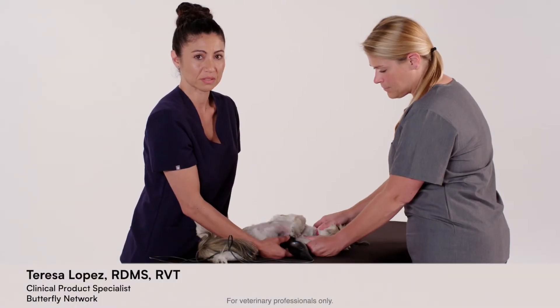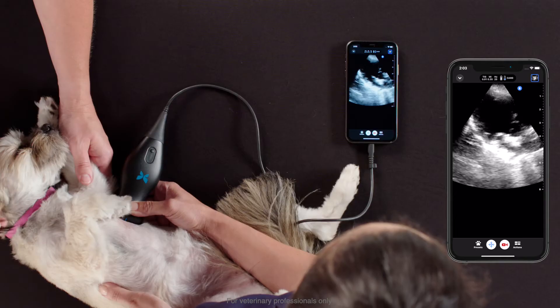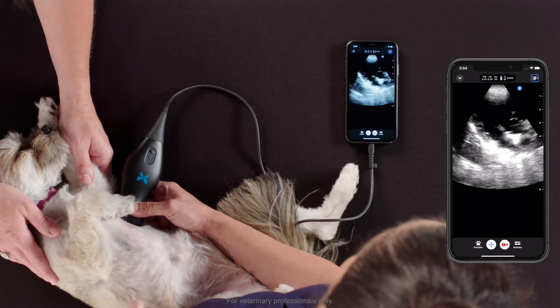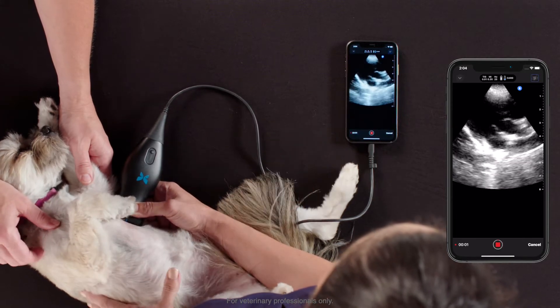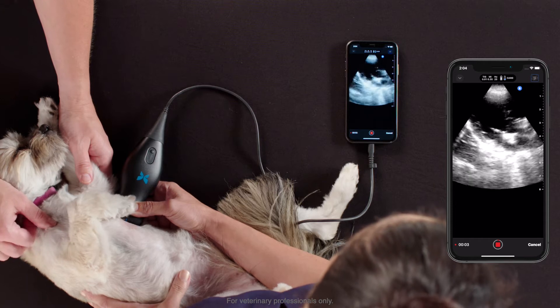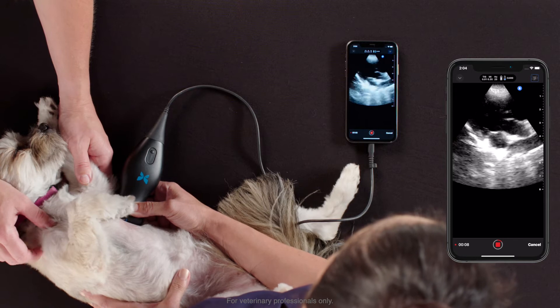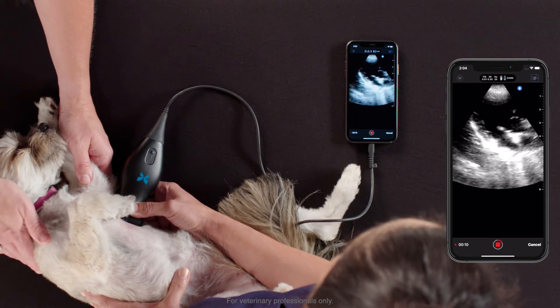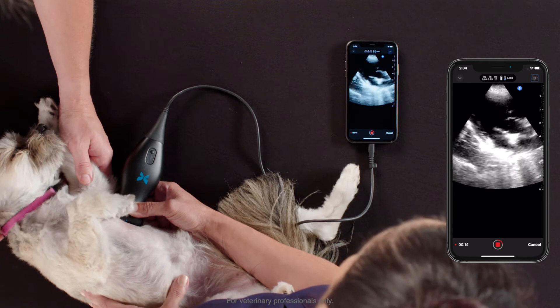With the butterfly, you have the option to either record what you are about to scan or record what you just scanned. To capture a prospective clip while I'm live scanning, I will tap the red camera and you'll notice in the bottom left hand corner a timer letting me know how many seconds I've captured. If I let this run, this will capture up to 60 seconds. At any time, I can stop the recording by tapping the red square.